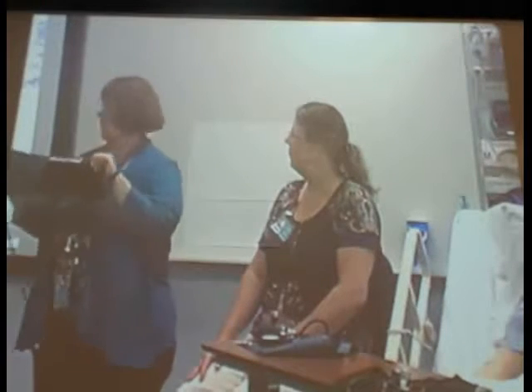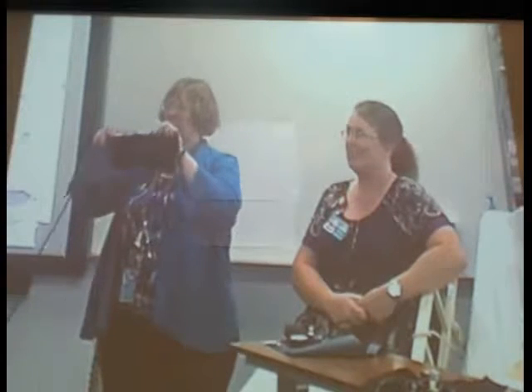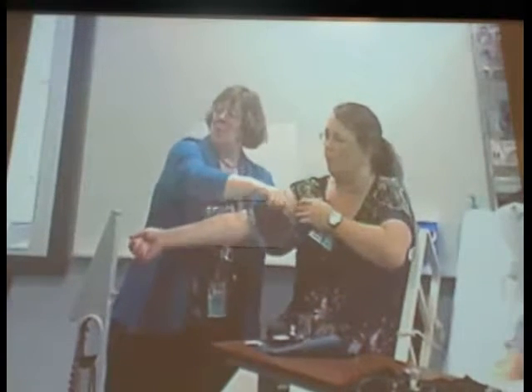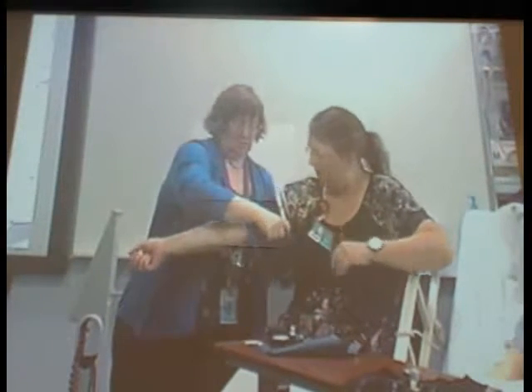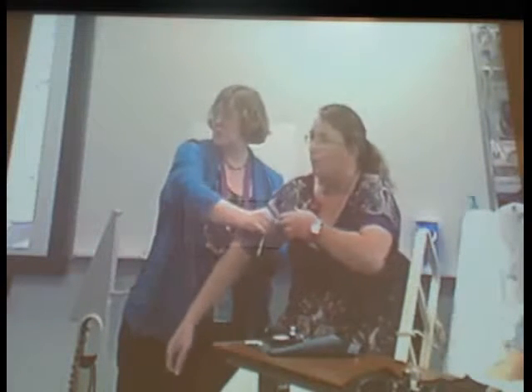So how are you going to know the right cuff size? On the cuff there's a range indicator. You'll take the cuff and put it around the arm about one inch above the antecubital space. On the other side there's a little arrow, and it should fall within that white range to confirm the cuff is the correct size.